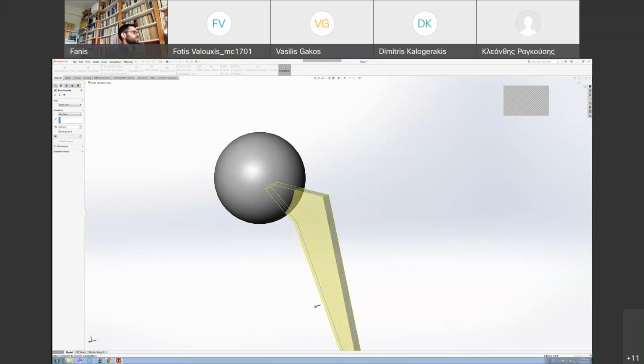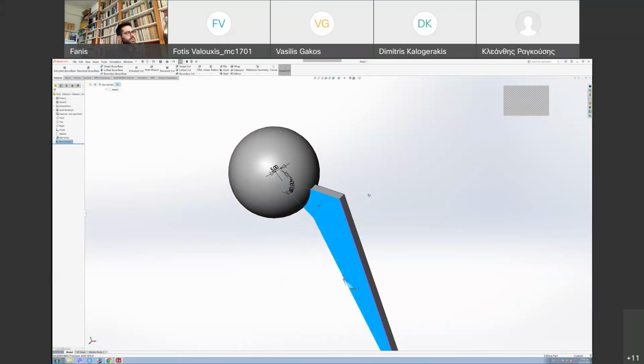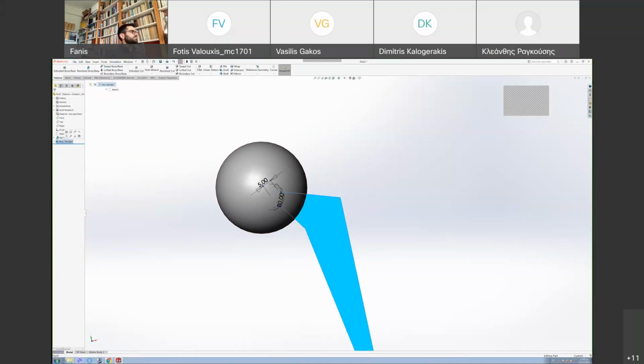One more important feature here, keep this merge result. If you don't keep this merge result, if you don't take it and you do this, then you end up with two intersecting bodies. You can easily correct this, in case you need it, by using the combine feature. But it's much simpler to just go here, edit the feature, and say merge the results.